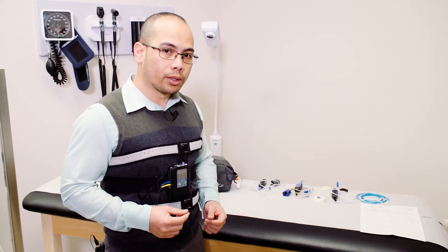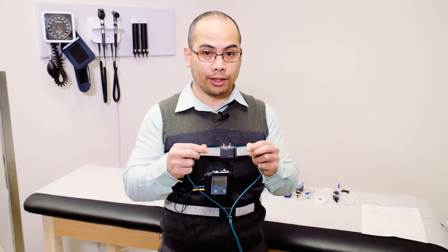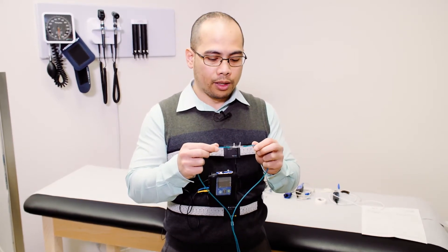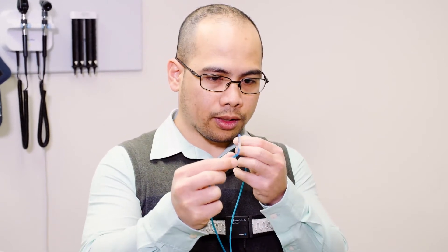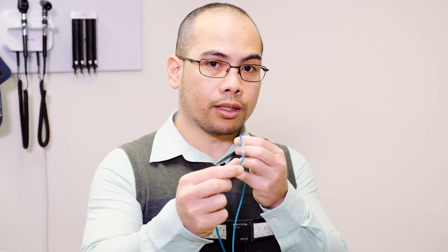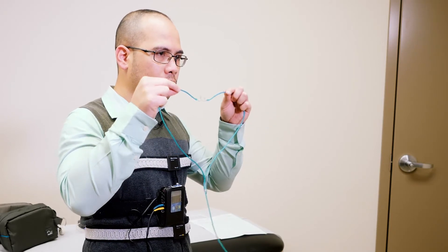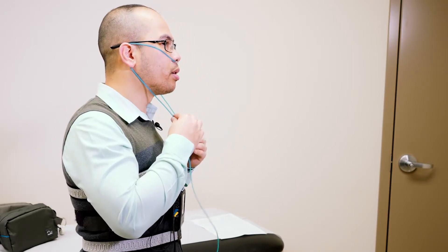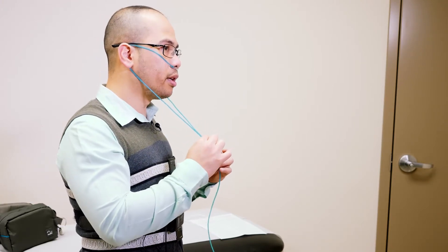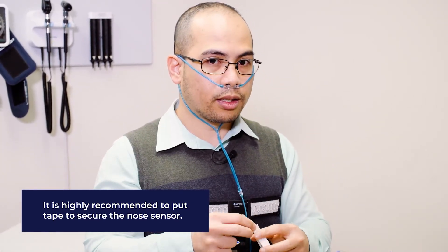The next one would be the nose sensor. This nasal cannula is the same cannula used with oxygen supplementation; however, in this particular test, it is not delivering oxygen. This is to monitor the flow of air in your upper airway when you're breathing in and breathing out. The prongs have a certain curve and need to be placed into your nostrils with the curve pointing inward. The prongs go into your nostrils while the rest of the tubing goes up and over your ears and loops around your chin. There's also a slider which you can tighten so that it's more stable and stays in place. You can also put tape over the tubing so that it's more stable.